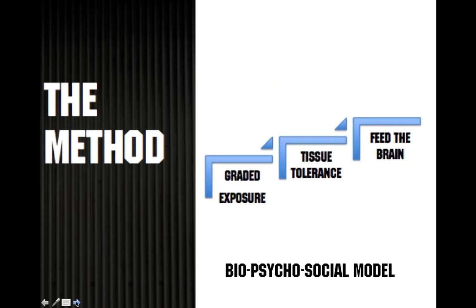Now, I discussed earlier about this idea of biopsychosocial models, and we're trying to, as a system and as a company, acknowledge that there's a lot more going on out there. It's not just mechanical. And Moseley and Butler truly talked about this idea of graded exposure and tissue tolerance. And what we've seen through the years of tools, we've seen that people tend to press really hard and cause this idea of petechiae on the skin to help with inflammation, actually increase the inflammation process and take out some waste products and help with healing faster.